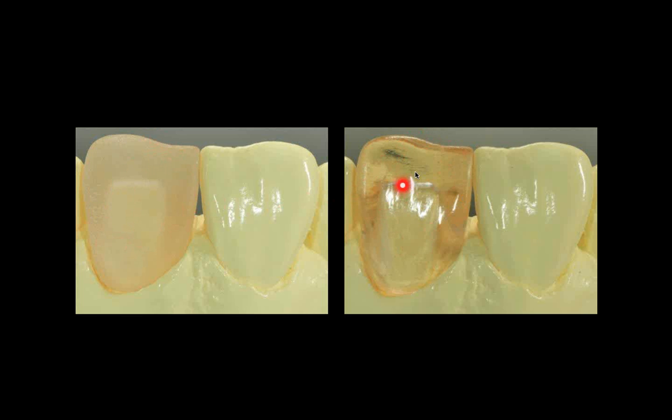On this one I see nicely, this crown is not fully down. So you see this little white line here. So it's not fully down, it's hitting the tissue somewhere here. Okay? So this really shows me by looking through the crown if it's completely seated.